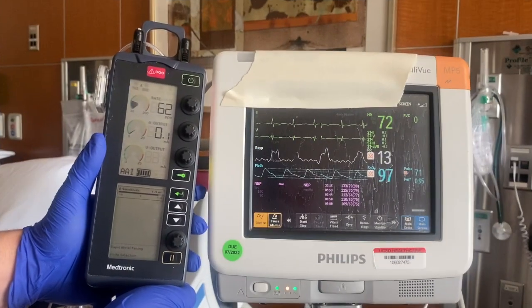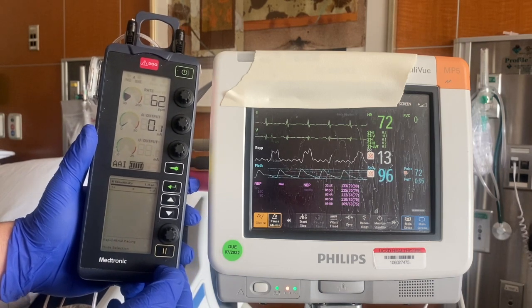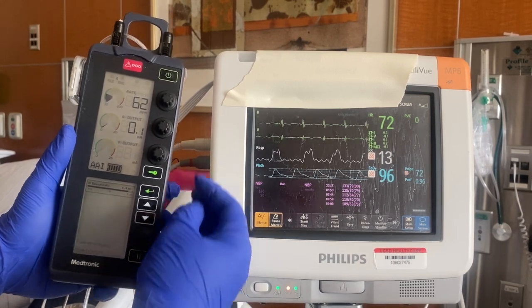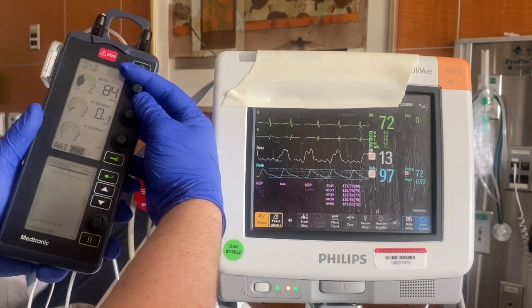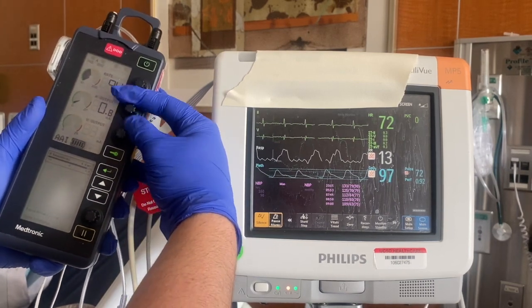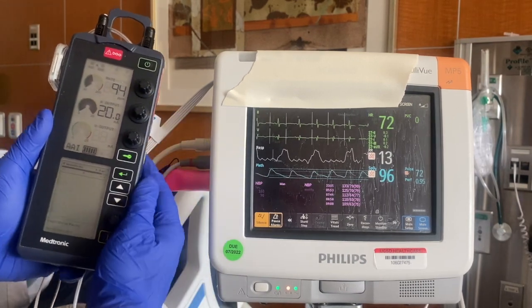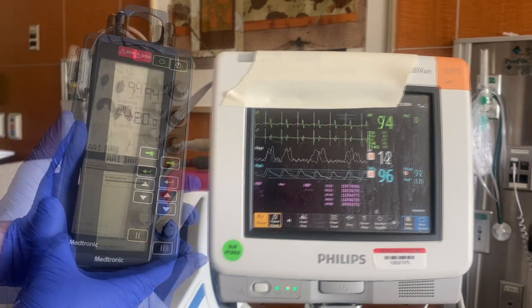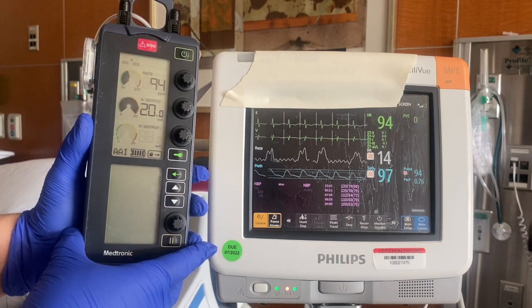Now that we have identified our threshold values for capture as well as sensitivity, we will go ahead and set the pacemaker box at those levels. The heart rate is to be set at 94, with a milliamp setting of 20, and the sensitivity will remain at 1.4 millivolts. This completes your threshold check for sensitivity and capture.